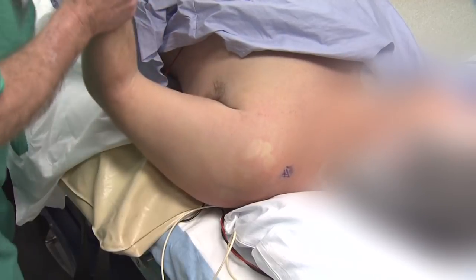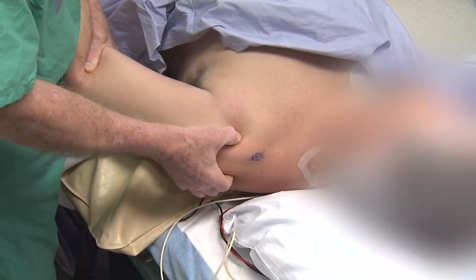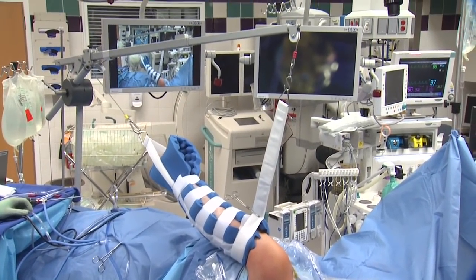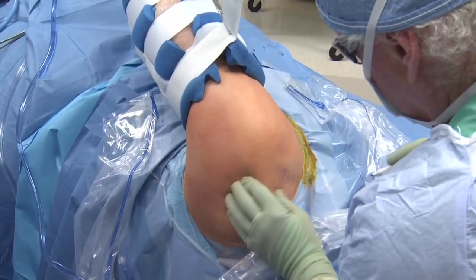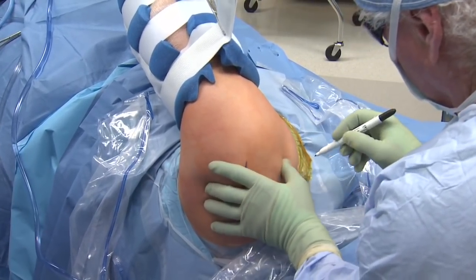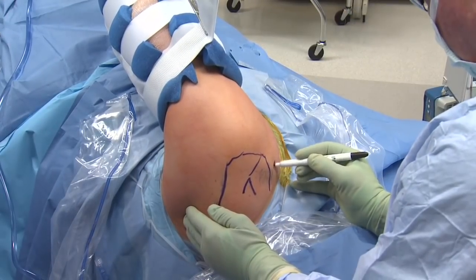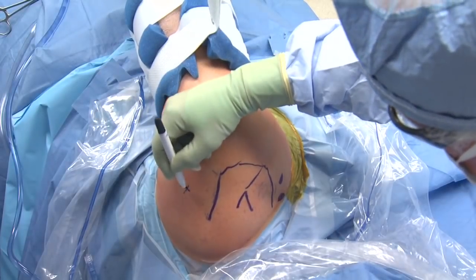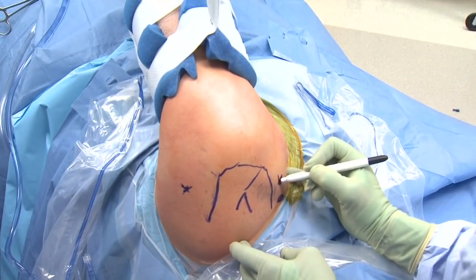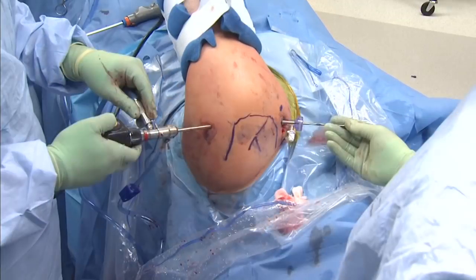The second step to success is to mark out the landmarks and ensure the portals are accurate and where we want them to be. Our setup uses a lateral distraction strap to laterally distract the joint. You can see here at the front, anterior to the AC joint, we have a universal portal and our posterior portal that we visualize through. We need space at the front for two portals because we really like to use a two-portal technique.